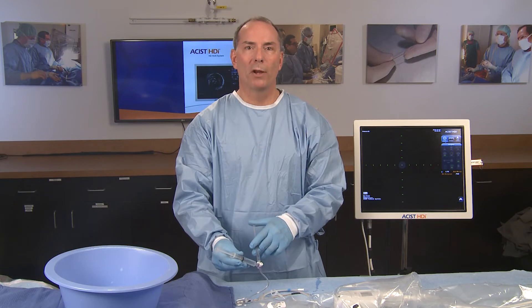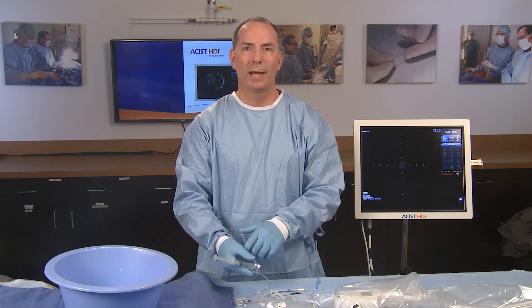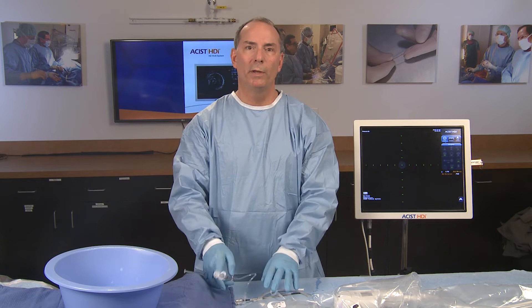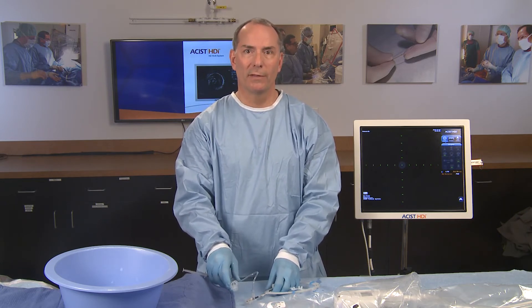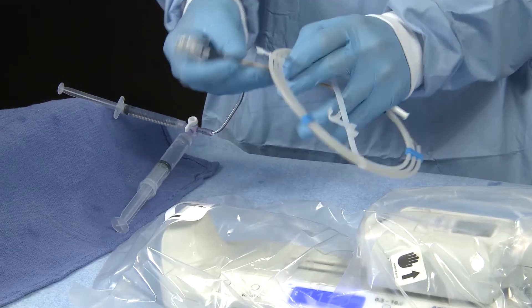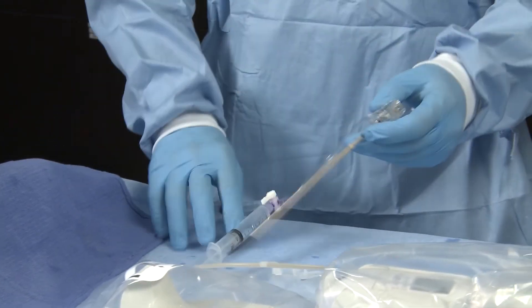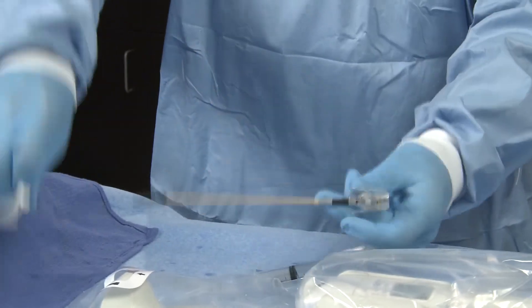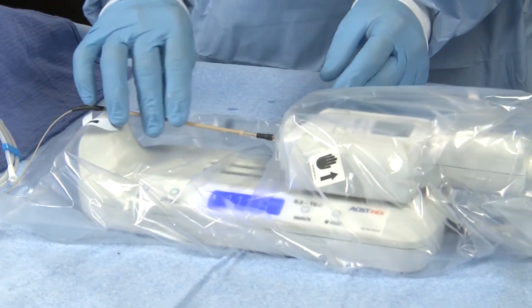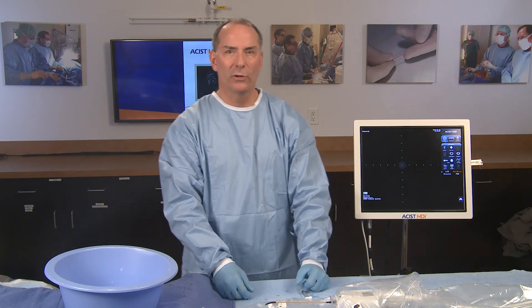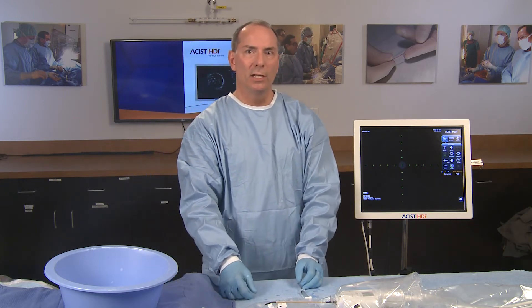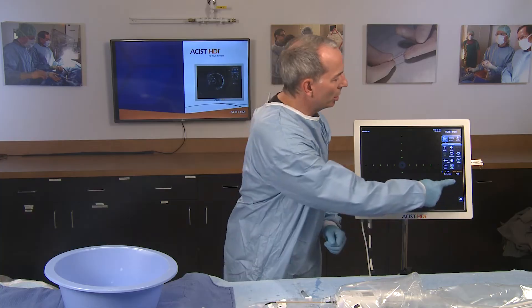The sterile operator may disconnect the proximal end of the Kodama catheter from the hoop and connect the catheter hub to the PIM through the sterile sleeve attachment. A discernible click indicates the catheter hub is fully seated on the PIM. Confirm the catheter indicator on the touch screen turns from orange to white.